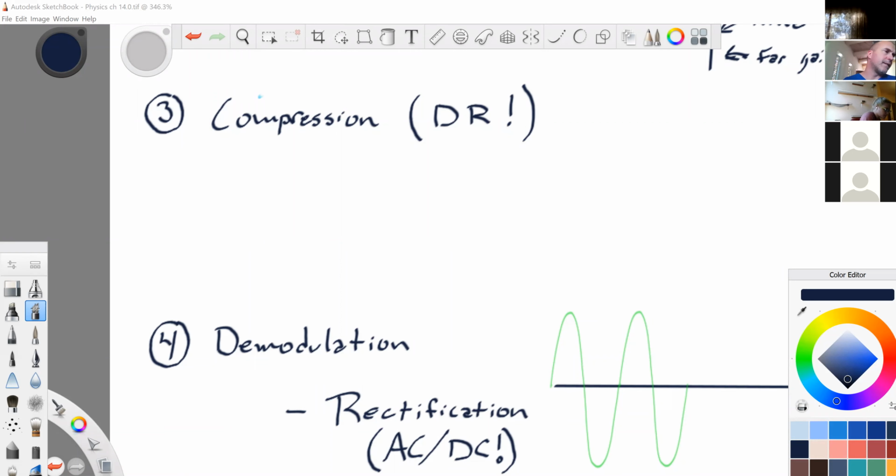Let's see, I have a note in here, I forgot. Important to note, although increased dynamic range makes a much nicer, more meaningful image, lower dynamic range increases contrast resolution. I'm going to hold off on that because I swear this book gives us two different answers on that. It's more contrasty when you have a lower dynamic range.